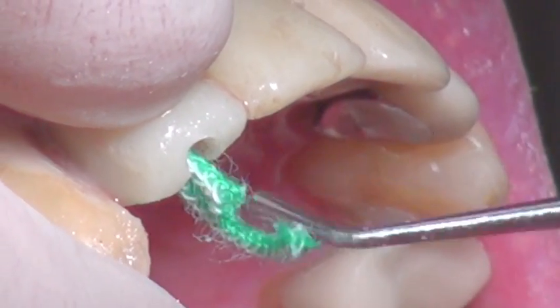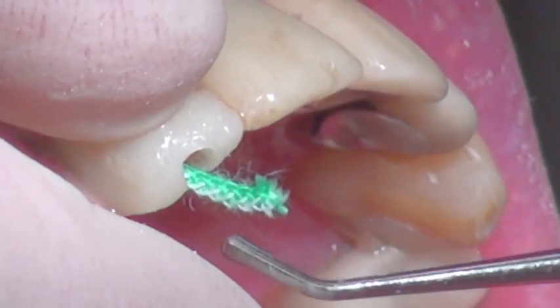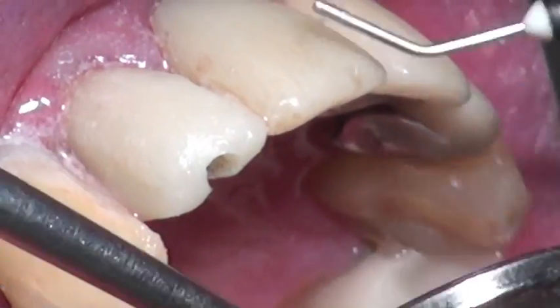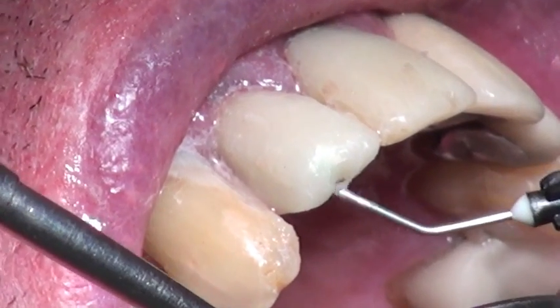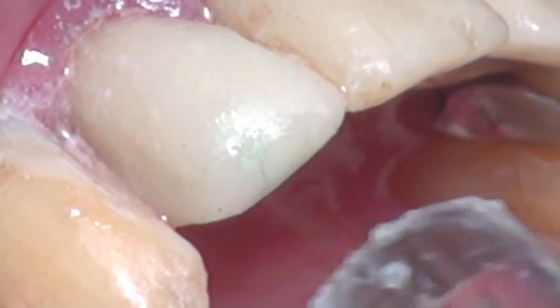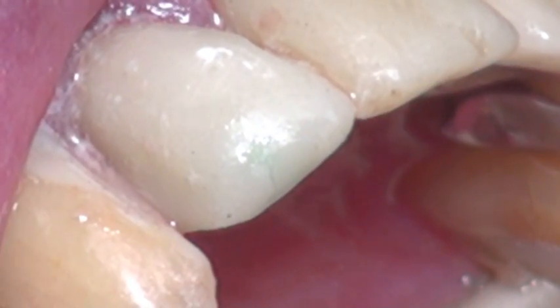Our goal is to try to make this a screw-retained crown — we are a little bit incisal in this case but should be able to achieve that later on. We place some resin in, making sure it doesn't impinge into the screw area at all, just sealing it off so it is going to be stable until the patient comes back — usually about 3 to 4 months later after the implant has been fully integrated. We want to make sure this is a non-functionally loaded implant, meaning no contact, no working, no non-working. We make this shorter than the other teeth so that it is not going to affect the occlusion.